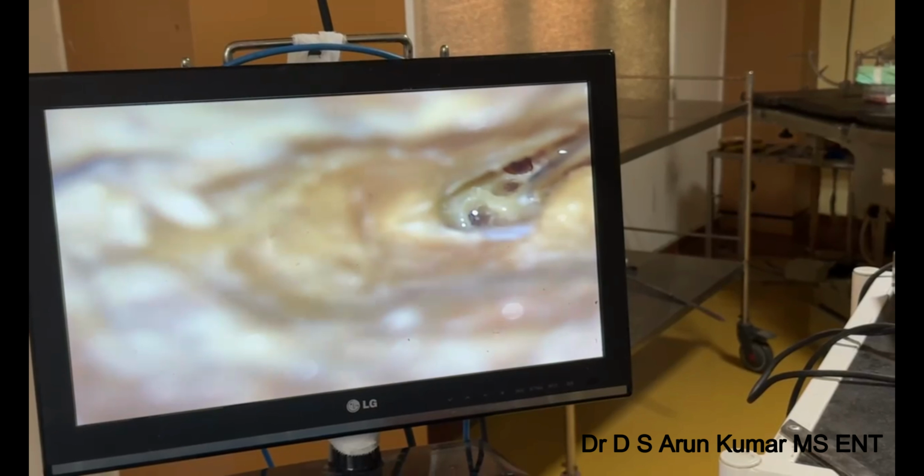In cases where the basal turn of the cochlea is ossified, you have to do insertion of the electrode through the second turn of the cochlea. For that, you have to do a cochleostomy anterior to the oval window. For doing this, you have to remove the incus buttress and also the incus.